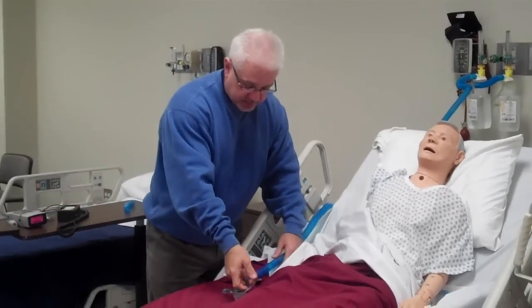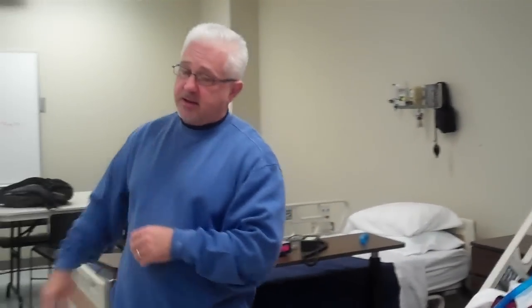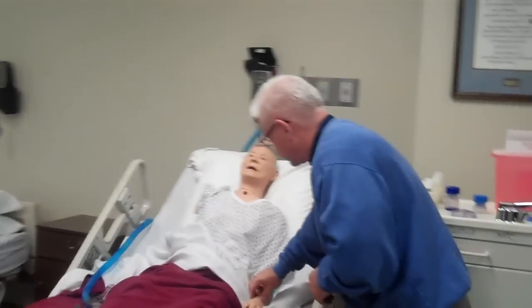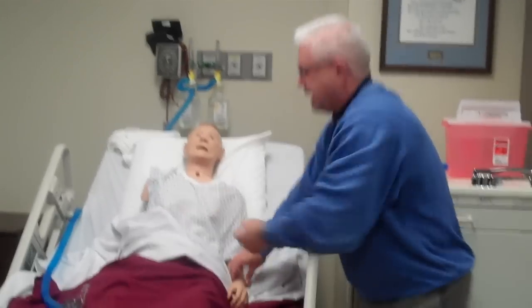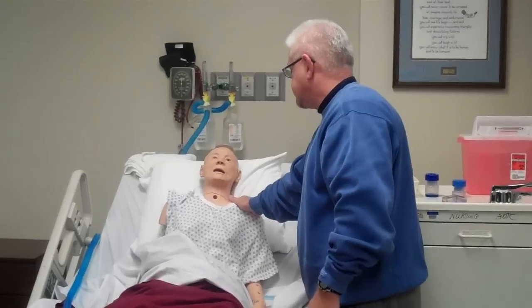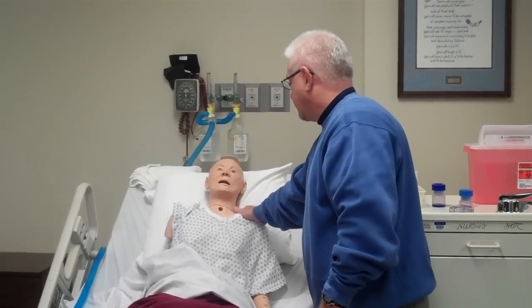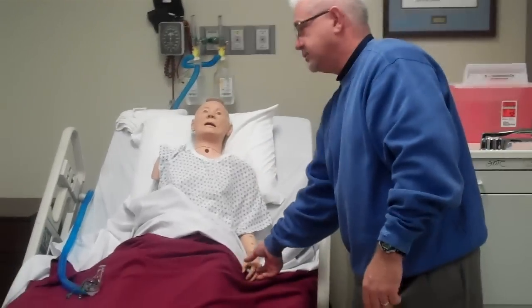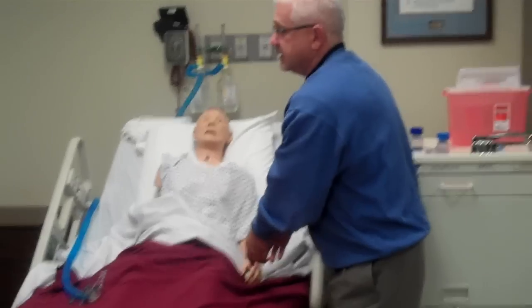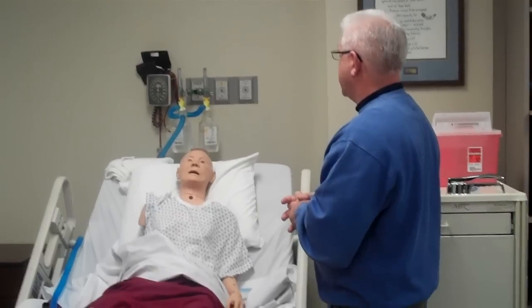Before you put the oxygen on the patient, you need to make sure you've checked the patient's heart rate, respiratory rate, sat, color, and level of dyspnea. I would check the patient's heart rate — come around, get their radial pulse. This patient only has one arm. I'd check their radial pulse, look at my watch, and count for at least 15 seconds. I would check the patient's respirations by looking at their chest, placing my hand on the shoulder or towards their back to feel their chest rise, or using my stethoscope to listen to breath movements in and out. I would check the patient's saturation by placing the pulse oximeter probe on the patient's finger and getting a saturation reading prior to oxygen. I would also ask the patient about their level of dyspnea — shortness of breath — on a scale of 1 to 5, with 5 being the worst.